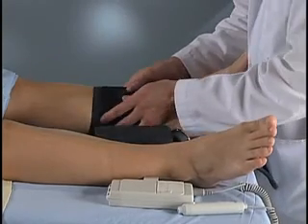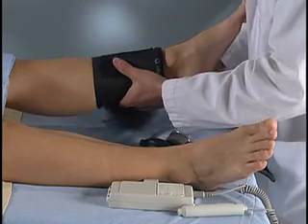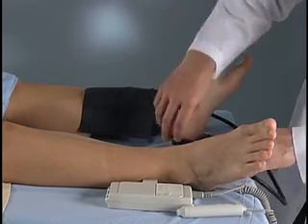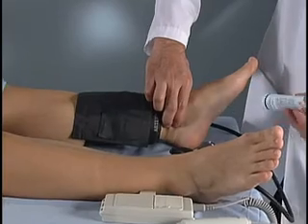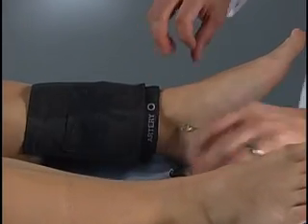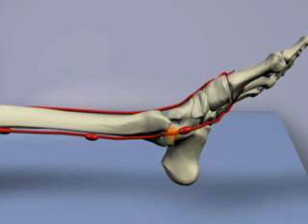Measurement of the ankle-brachial index represents a non-invasive and objective way to diagnose peripheral arterial disease. This test has been reported to have more than 90% sensitivity and more than 95% specificity for the diagnosis of peripheral arterial disease. This test may be performed in the physician's office and is a helpful adjunct for diagnosing peripheral arterial disease.